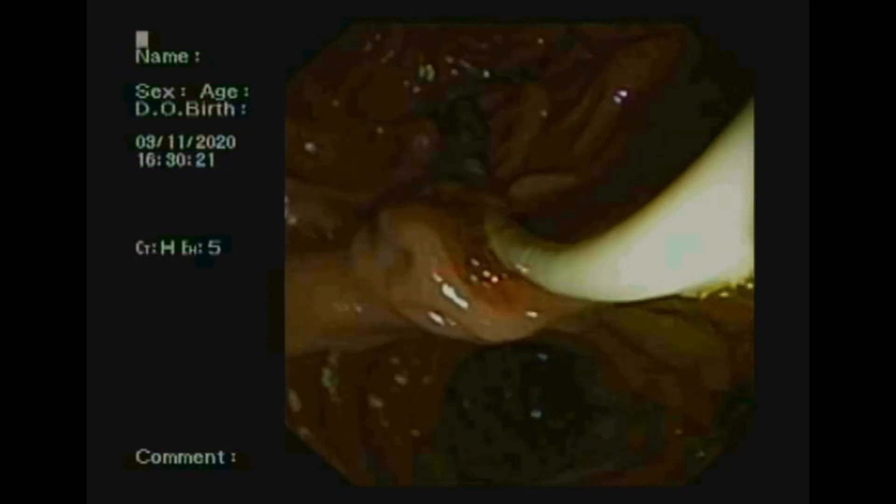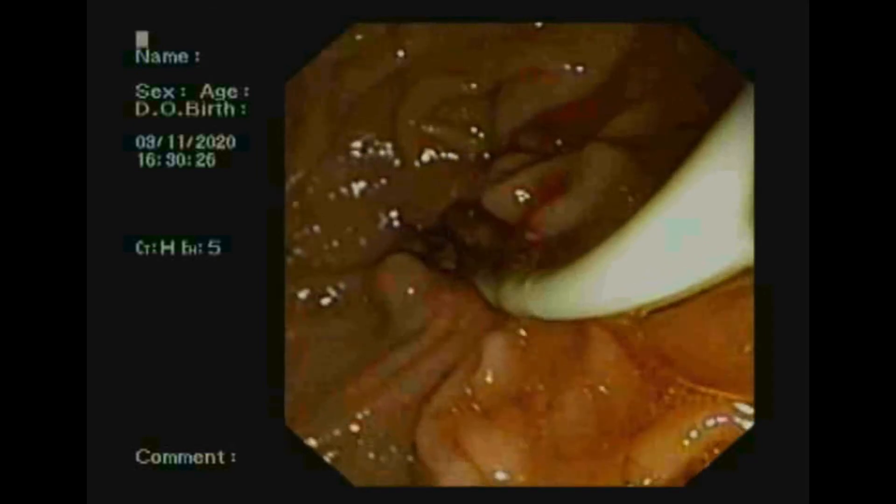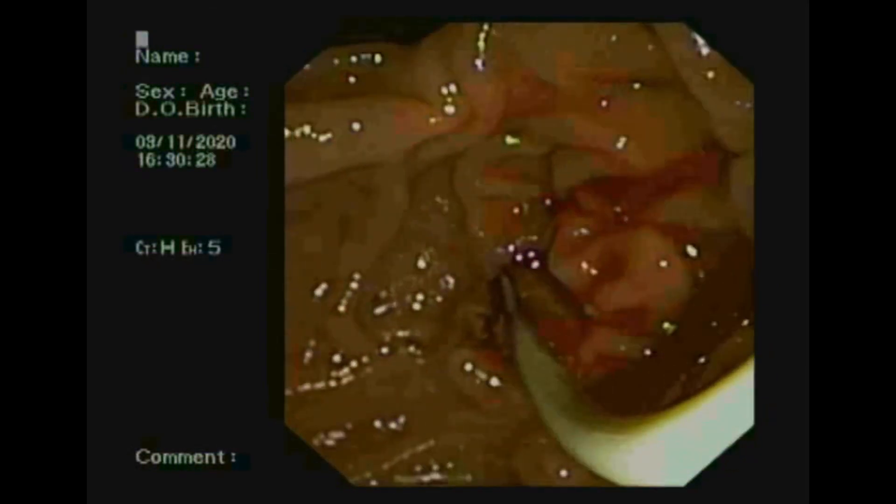Balloon sweep was done multiple times, and multiple black stones were removed from the CBD. The CBD was then cleared.